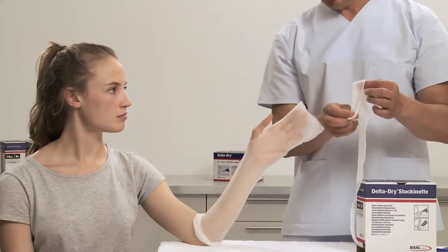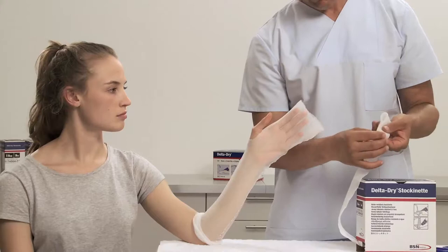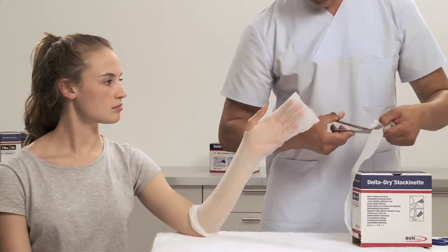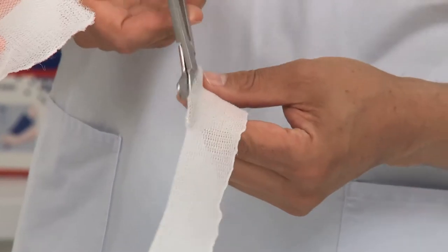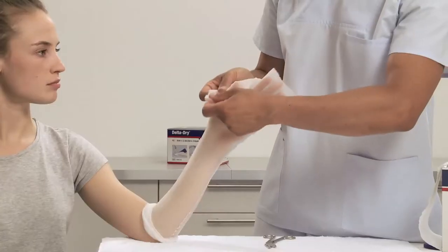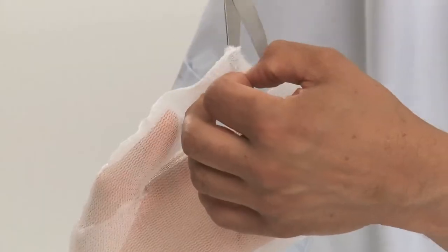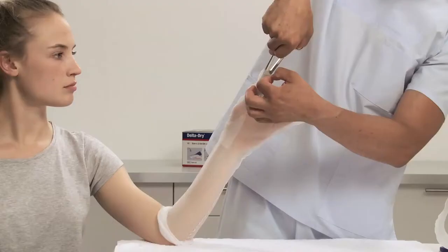Cut a small piece of 2.5 cm or 1 inch width Delta Dry Stockinette to protect the thumb area. Make a cut into the piece and slide it over the thumb. Cut the piece from the distal side.